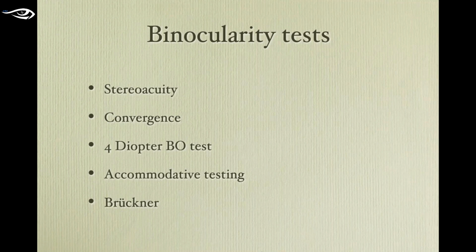You expect to find that eye make a transient movement outward and then a transient movement inward. So Hering's law says you've now moved the image on the eye behind the prism to a nasal point. Hering's law says nasal movement of the image on that one eye is going to cause a temporal movement on the fellow eye, and then there'll be a refixation movement inward on the fellow eye. So you now put the prism in front of the other eye, and you see no movement on the fellow eye.